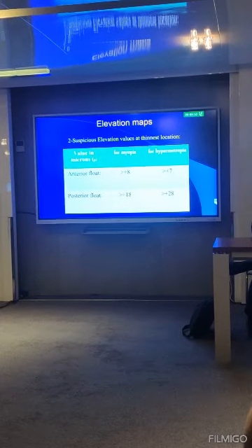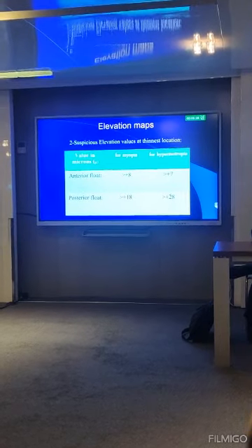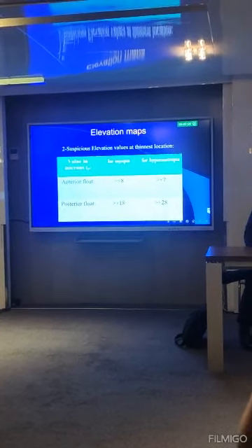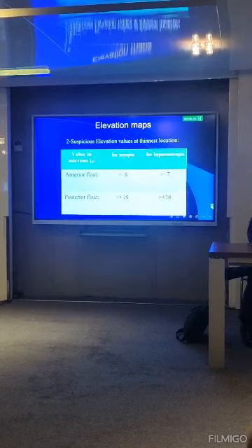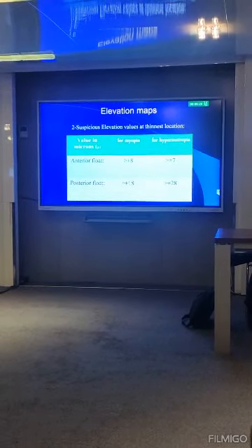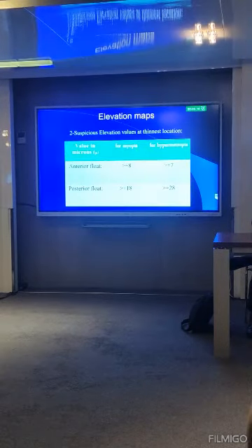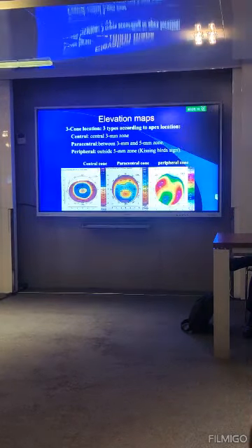Suspicious values for elevation and thinnest location according to the best fit sphere: in the anterior float more than plus 8, in the posterior more than plus 18. For hyperopia, the values are a little bit higher, in the anterior plus 7 and posterior more than plus 28, because of course the risk of ectasia after hyperopia is much less than in myopia.